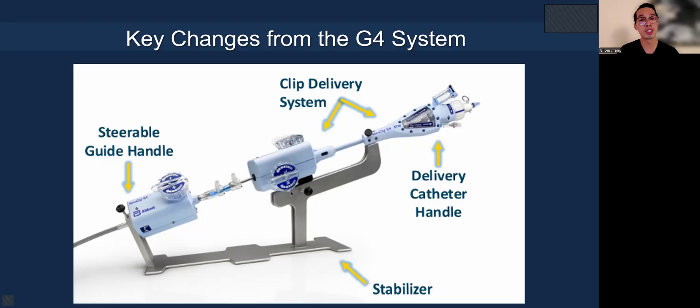Let's go back to the G4 system, since it is still utilized in some parts of the world. There's the steerable guide handle, and you can see there was a screw that had to be fastened and secured to prevent the guide from rotating freely. The clip delivery system also has a screw mounted on the rail to secure it in place. There's also another screw required to secure the DC fastener, especially when you try to rotate the clip or advance or retract — you need that screw to fix the DC fastener to the CDS.